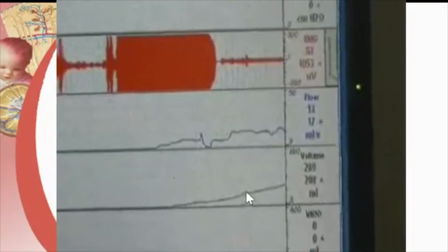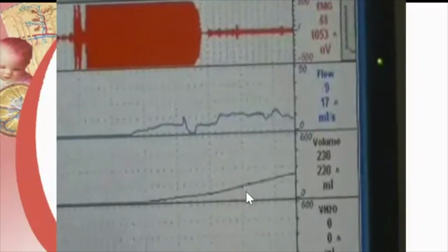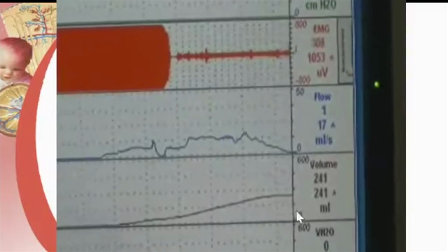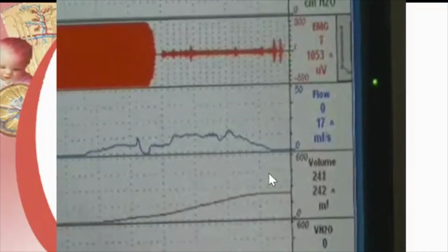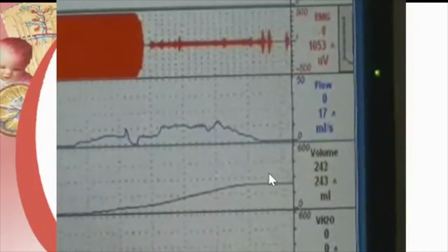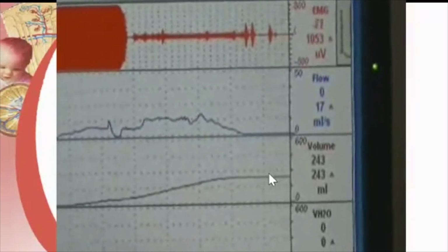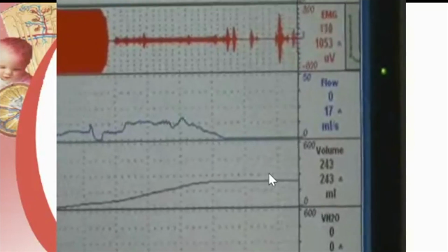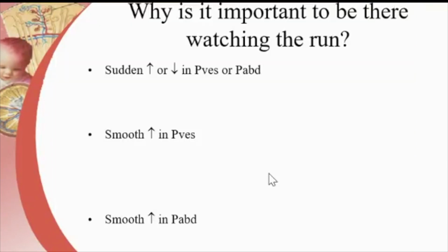This is an older patient. Obviously, you can get a voiding phase. In younger children, you cannot get a voiding phase. So he voids a prolonged trace, and he is generating a very poor abdominal pressure. So this is a large capacity decompensated bladder, more like an atonic bladder. So it is in the third stage of a valve bladder, and that is bad news. So he needs to go on CIC.